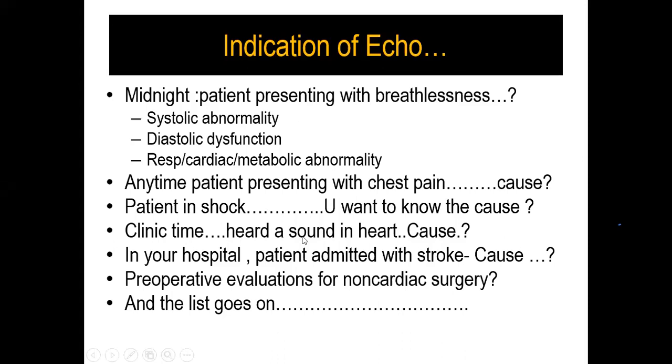Who can tell you all these kinds of things? Echocardiography. You heard a murmur in the heart, you want to know the cause. In your hospital, a patient is admitted with stroke. What is the cause of this stroke? Is it atheroembolic or atherothrombotic? And last is the preoperative evaluation for non-cardiac surgery. In this medico-legal era, for every person who has some cardiac illness, we have to classify whether they carry some risk during surgery or not. And this list goes on, and virtually every field is talking of echocardiography.